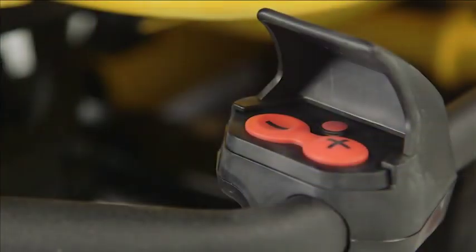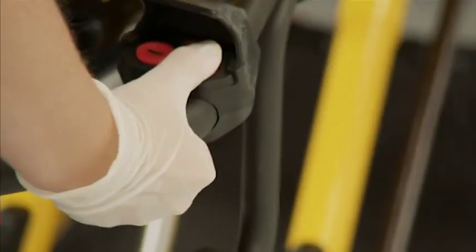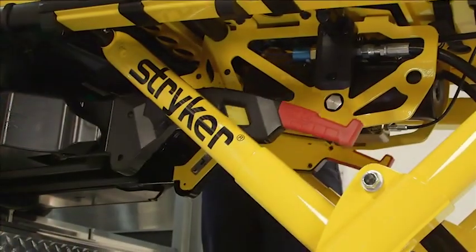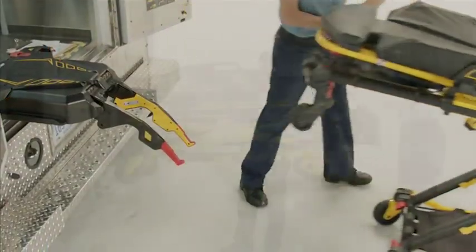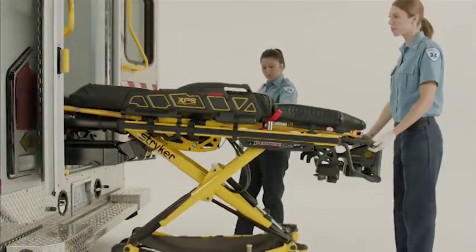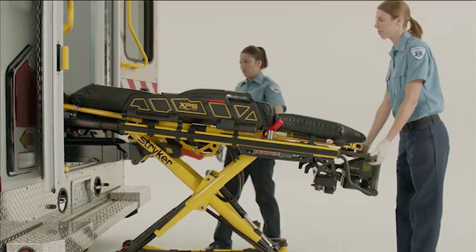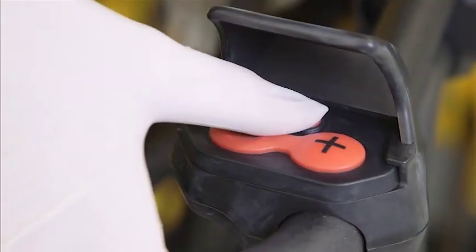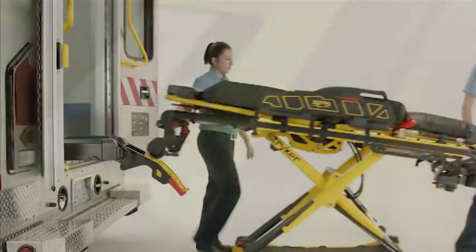Next, press and hold the plus button on the PowerPro cot until the cot undercarriage is fully extended with the wheels on the ground. The operator may release the plus button once the cot is no longer supported by the PowerLoad lifting arms. The lifting arms will continue moving until they have lowered completely. There are two ways to release the cot from the trolley. The foot-end operator can press the third small red button on one of the cot controls and guide the cot out.